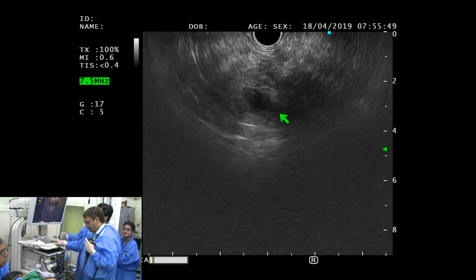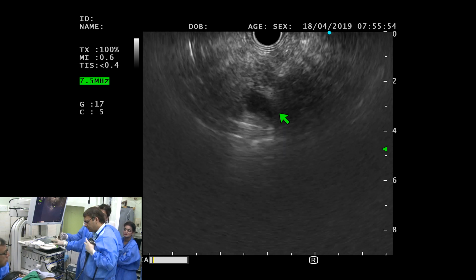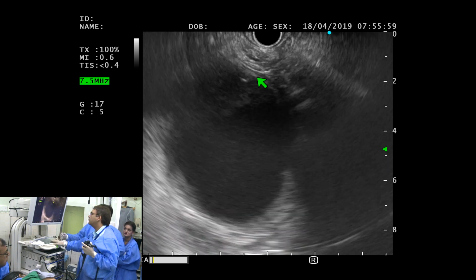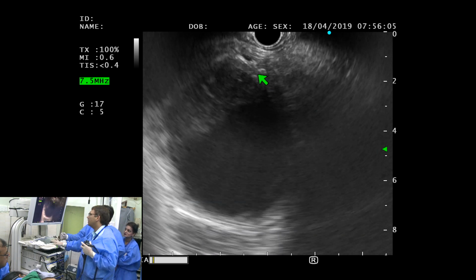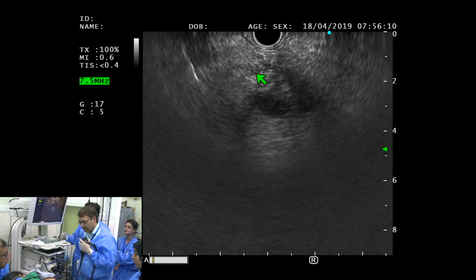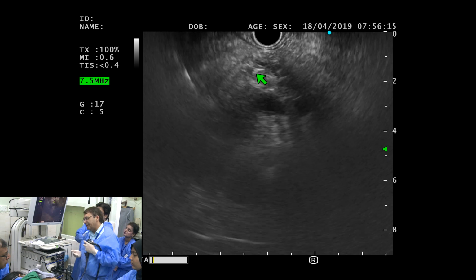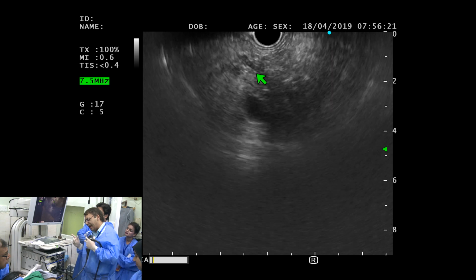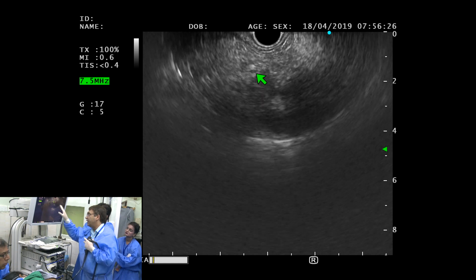You can see the spleen, left lobe of the liver, left adrenal and kidney. Yes, so these are the structures that you generally see. I know you can see the bile duct also from there, but mainly this is what you're focusing on, correct? That is correct. And the only movement you made was basically rotation with the straight scope. I did move the scope back a little bit without even using the right hand most of the time, because I'm keeping a little bit of traction on the scope, and I'm looking at the screen. I see where the duct is.